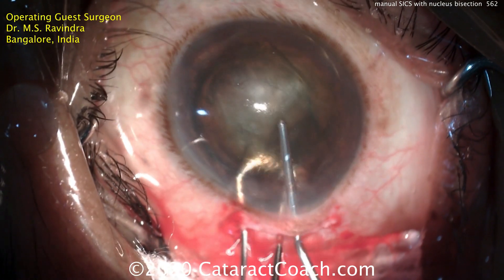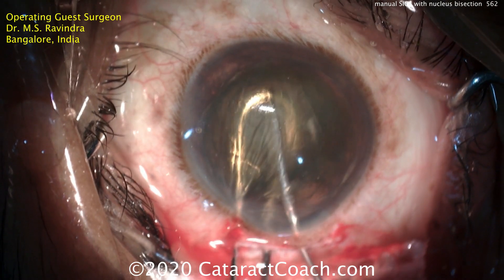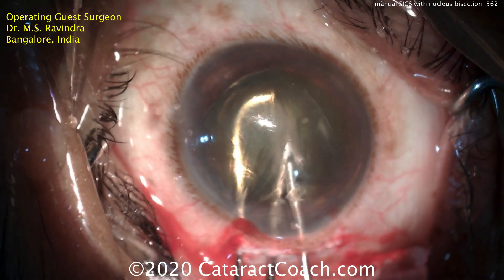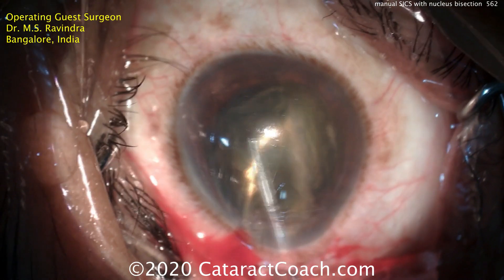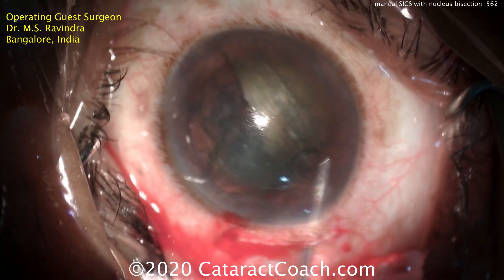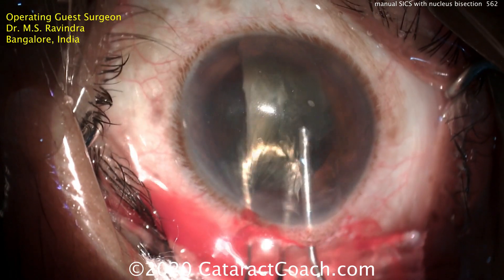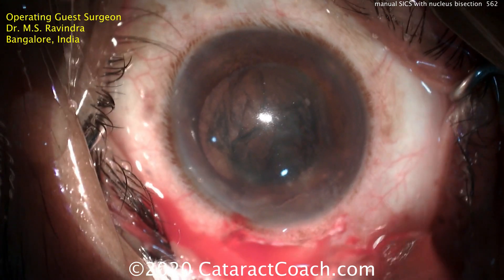The vectus is underneath the nucleus and the 27 gauge cannula is above. Just using the force of pushing instruments together, he's able to bisect this nucleus — a little bit of work involved there. Once the first piece is bisected, it can be removed from the eye very nicely.